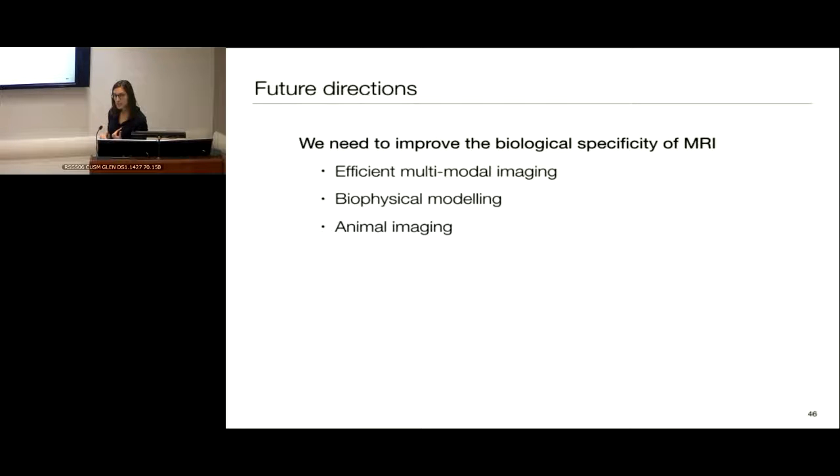From the point of view of a neuroscientist, I'm actually using these animal experiments very differently, where I temporarily accept that our imaging techniques are not perfectly specific to myelin content, and I try to win back that specificity by using animal models. Animal models where we can start to play with the myelination, for example, stop new oligodendrocytes from differentiating and forming new myelin sheaths, and these types of things. And there we can then use MRI to image the animals longitudinally. So we regain our specificity by the animal models. We have MRI to look at longitudinal changes, which means that we can start to look at causal effects of myelin on behavior and cognition.